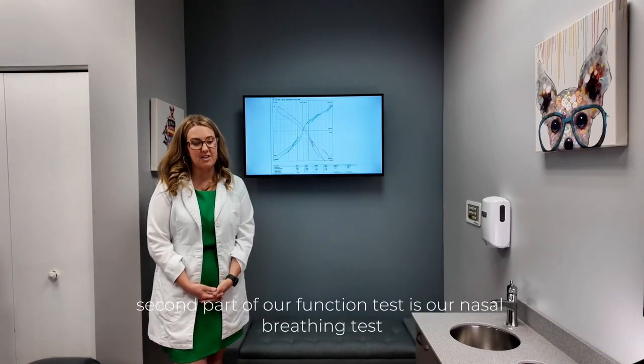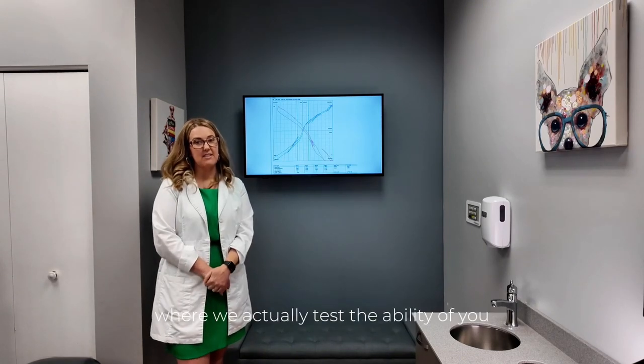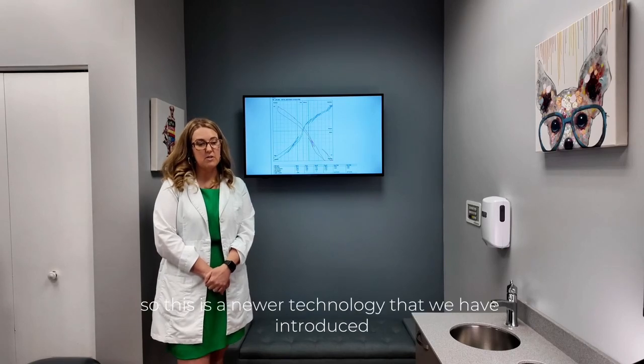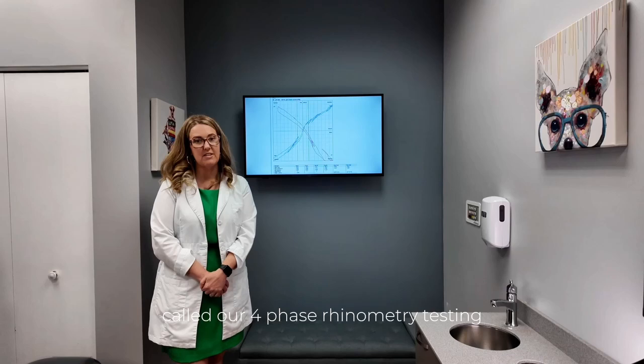Second part of our function test is our nasal breathing test, where we actually test your ability to breathe through your nose. So this is a newer technology that we've introduced called our 4-phase rhinometry testing.